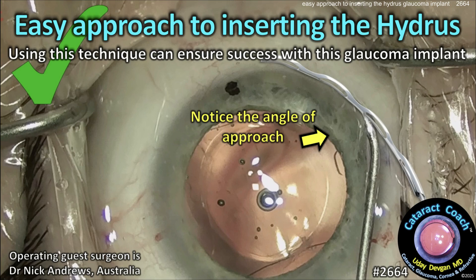CataractCoach.com — an easy approach to inserting the Hydrus. I saw this lecture given in Australia and I thought, wow, that's really a great video. I've got to share it with my CataractCoach fans. So let's check it out together.